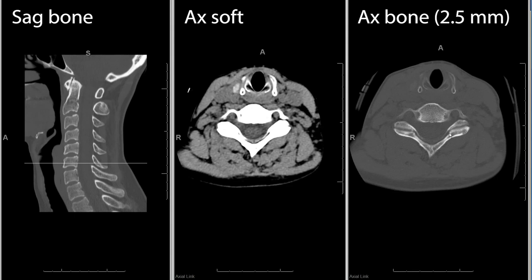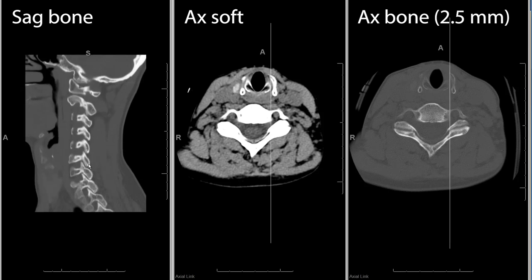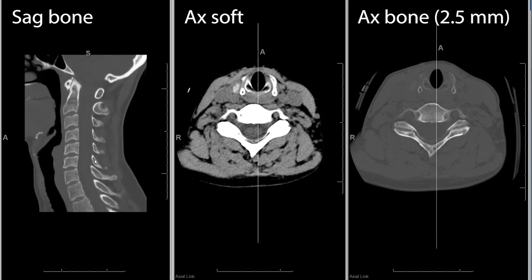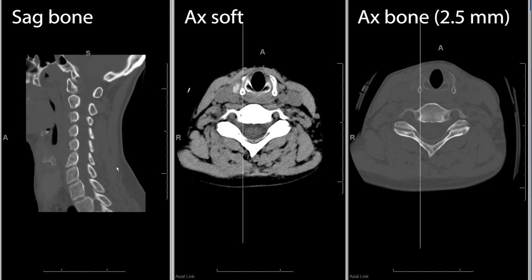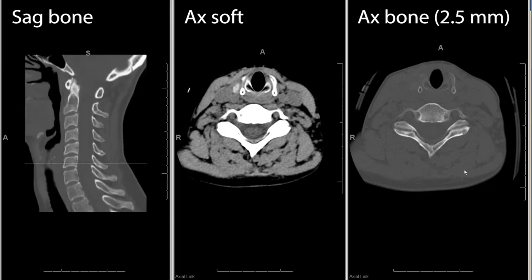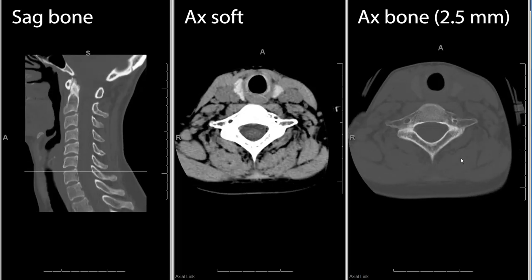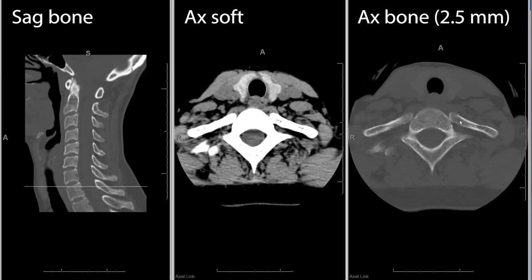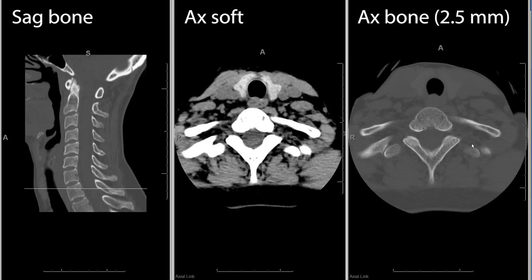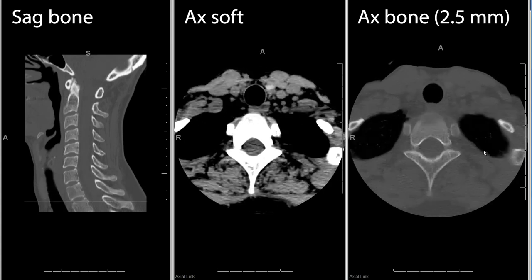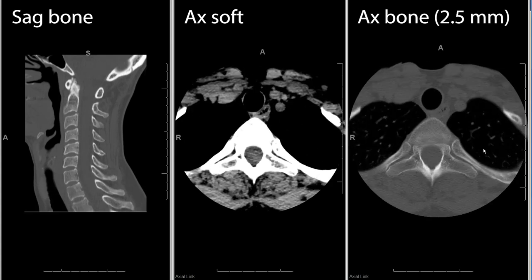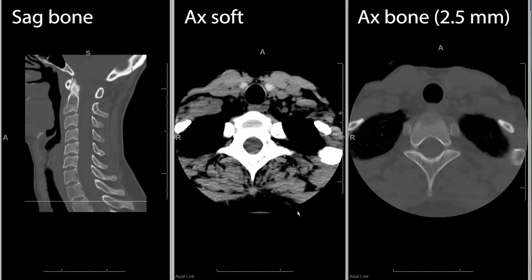For instance, you see a slice going through the facet where in the old days it would be very challenging to tell whether this was a jumped facet or not. But for us it's very simple because we go through and check on the reformatted images — we just happened to catch it between slices. Keep going down and you're going to see your upper thoracic vertebral bodies, the first rib and first couple of ribs, and your lung apices as well.